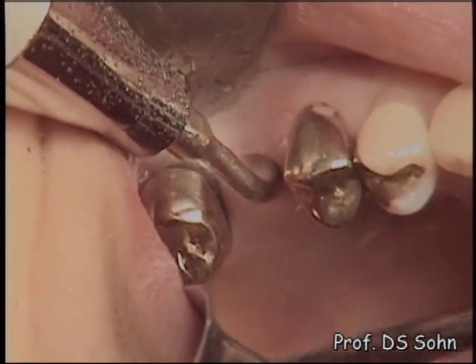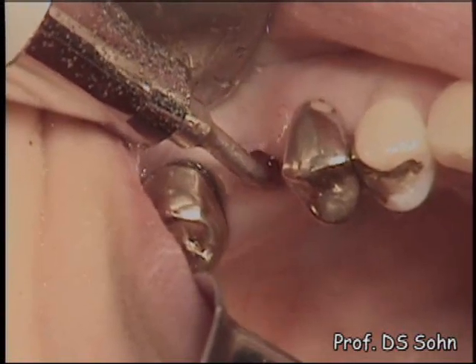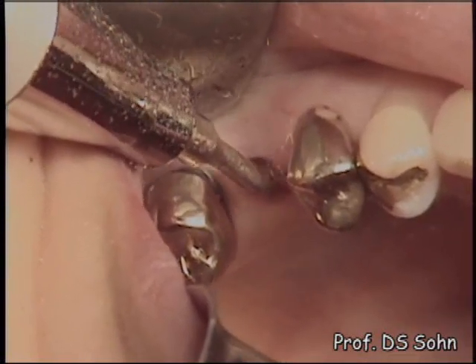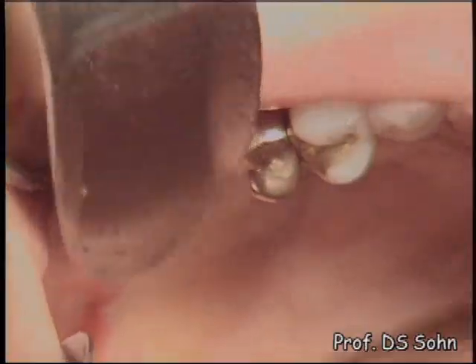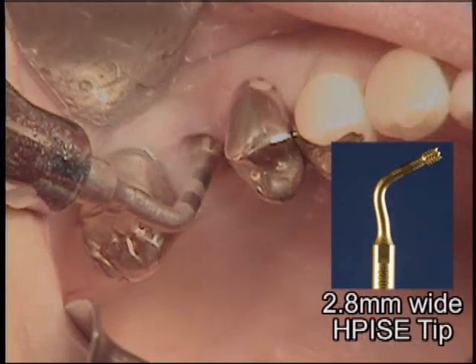Thanks to the micrometric cut effect and selective cut effect, the rate of membrane perforation is very low after breaking the sinus floor. When approaching the sinus floor with a round carbide tip, the tip should be moved in a circular motion or bone scraping motion in order to prevent mechanical membrane perforation.